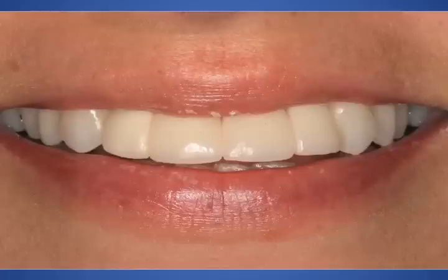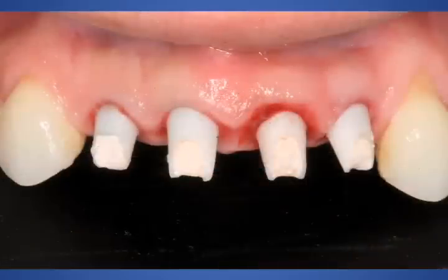Now, after approximately 4 months of integration, we used our standard impression technique to fabricate our final zirconia abutments. So we take a normal impression, and the laboratory will then do their artistry to create 4 single zirconia crowns. Here you can see the zirconia abutments in place. They are torqued into position, and I put a little Cavit over those screw holes.